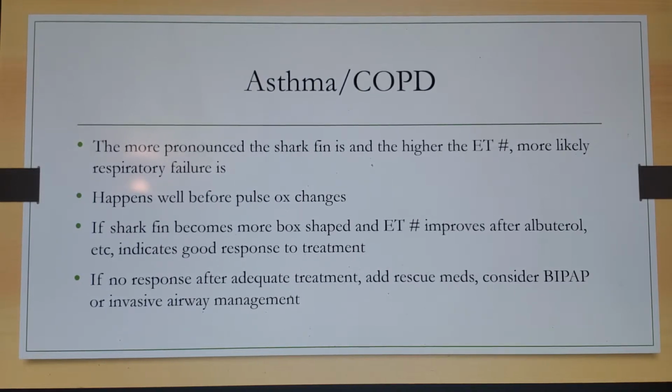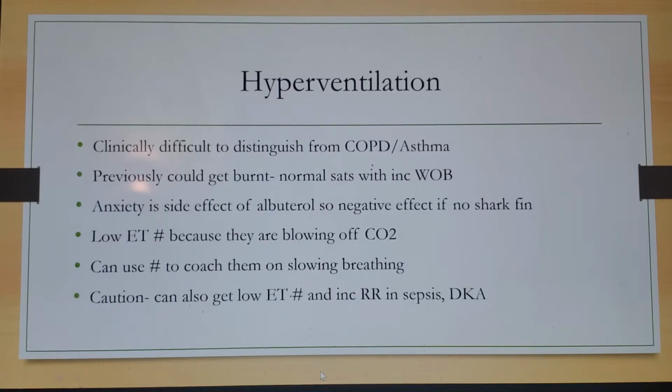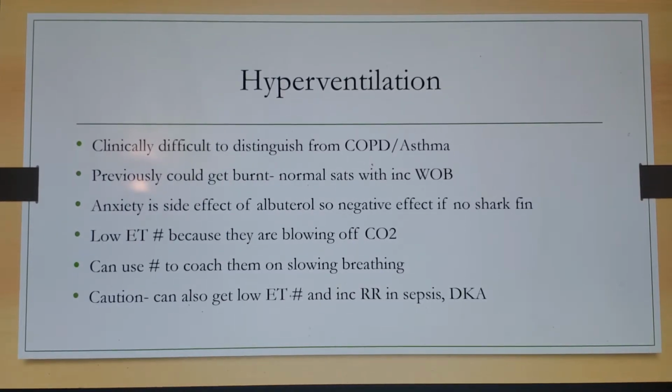things like that. Conversely, if they have a shark fin and their waveform starts to become more box-shaped, and that end tidal improves after albuterol, steroids, whatever else you've done for them, then that would be considered a good response to therapy, and you'd want to continue supportive care. We talked about this a little bit.